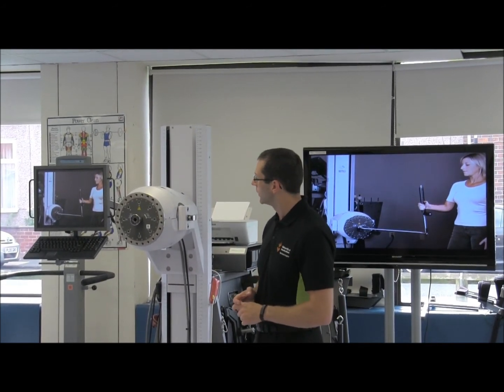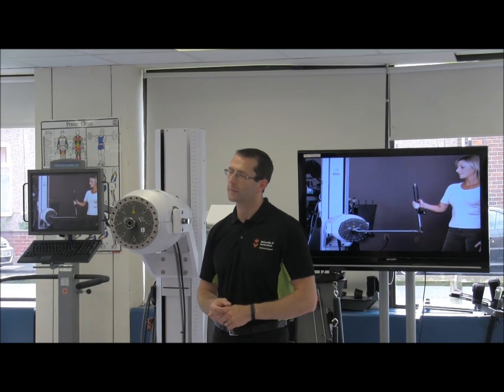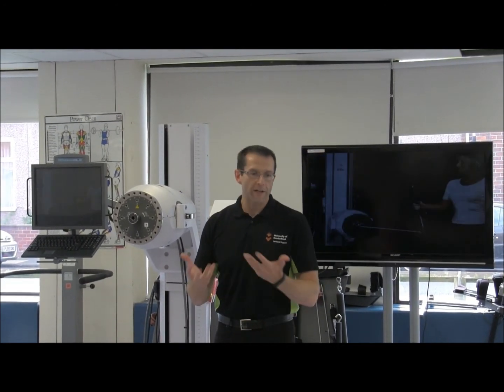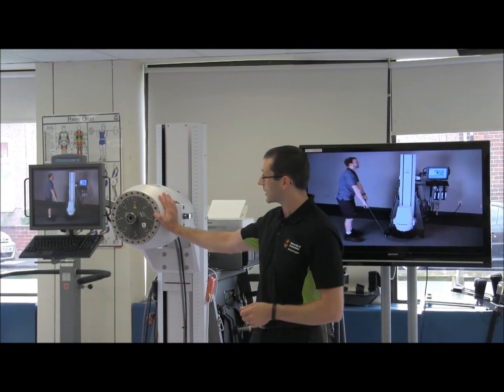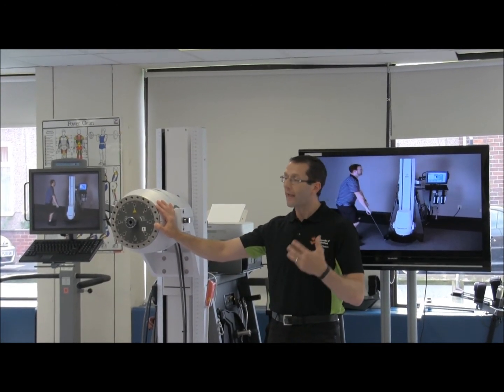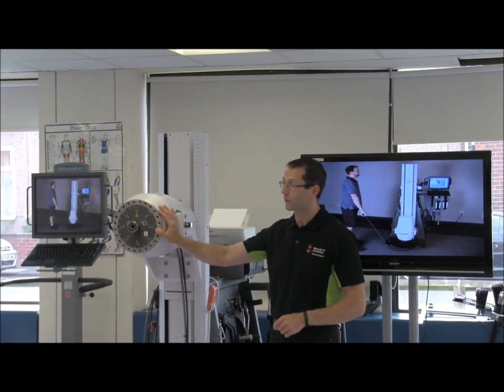Eccentric training can be quite useful for us, but it's very difficult to do with normal free weights — we have all the S&C stuff with the Olympic bars over in the corner there. With free weights you lift a weight concentrically and lower that exact same weight eccentrically. One of the benefits of this system is that it allows us to concentrically lift a certain weight, but then overload the eccentrics as well — we can tell it to put a bit more resistance into the eccentric side.